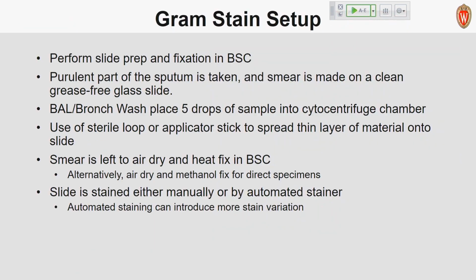Moving on to the gram stain setup. Unsurprisingly, you're going to perform the slide prep and fixation in a biological safety cabinet. You don't know what's in that sample, and that's just good microbiological practice. You're targeting the most purulent part of the sputum to make that slide.